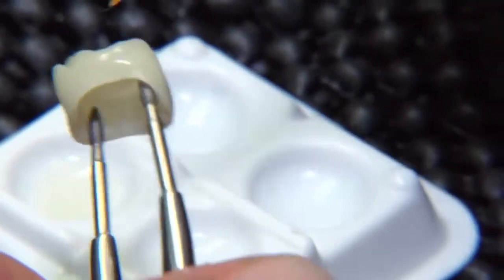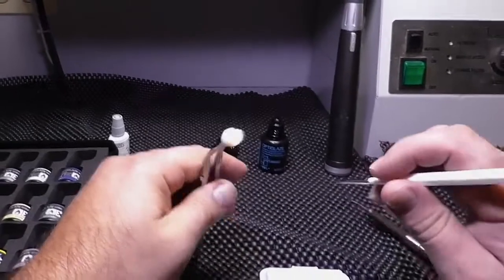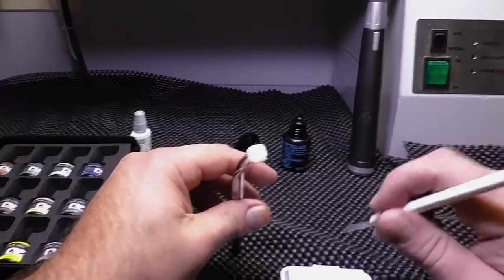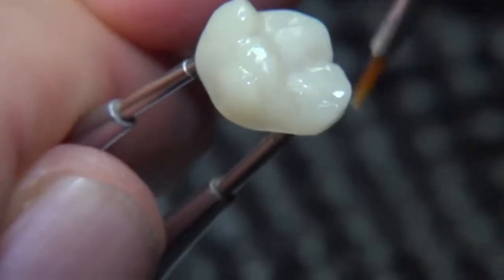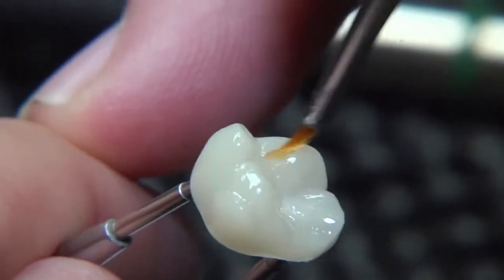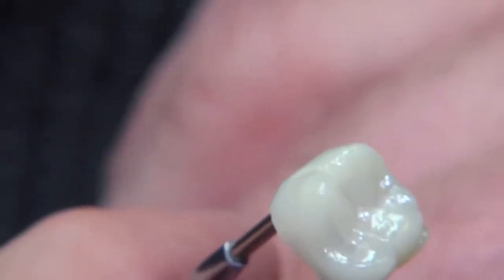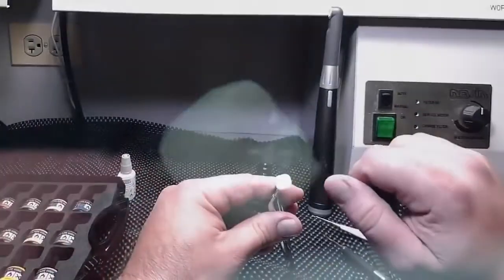You can use just the OptiGlaze color on its own, but one recommended step would be to use the Ceramic Primer 2 so you have better adhesion. Once that's done, go ahead and let it air dry, or you can use an air hose to manually dry it.